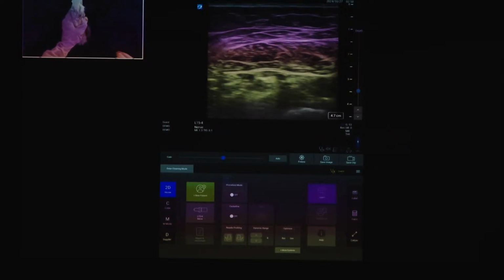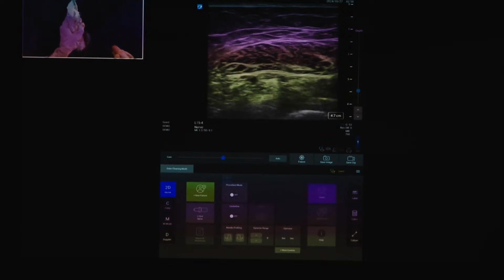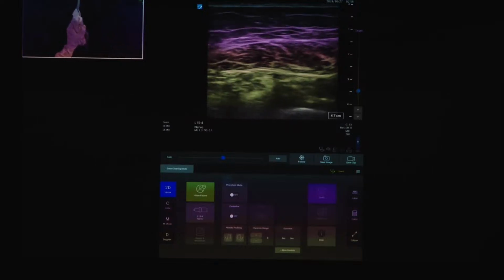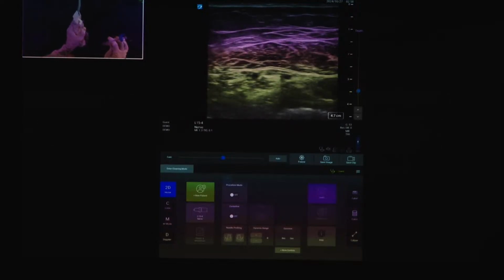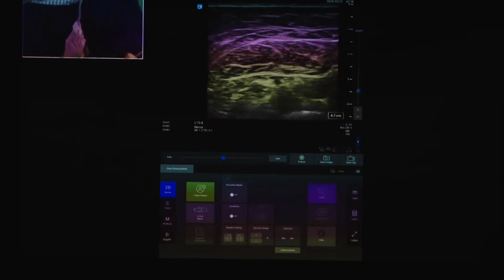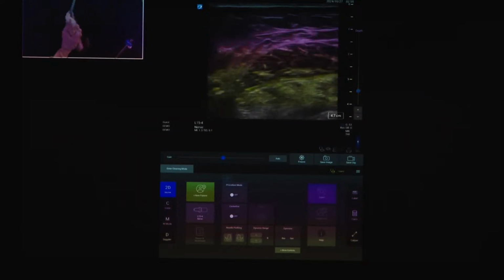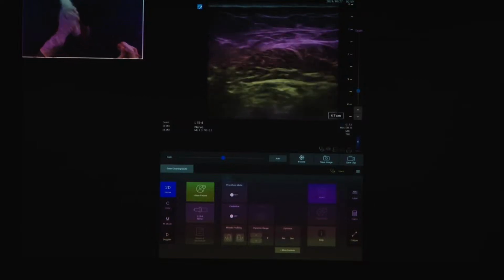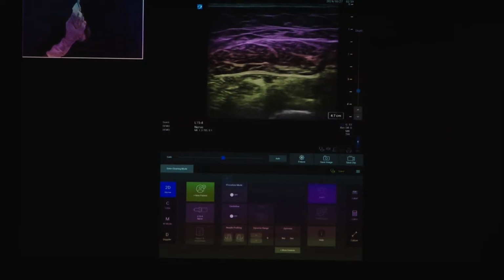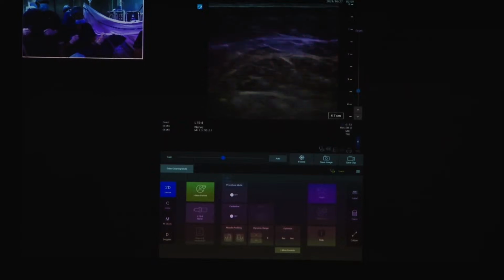Actually, this is a 77-year-old patient, as Dr. Nagalaxmi told. Today only she got operated, and we are doing adductor canal only. IPACK is not being demonstrated because there is already a bandage and all. The position of the patient is supine, with the limb slightly externally rotated.